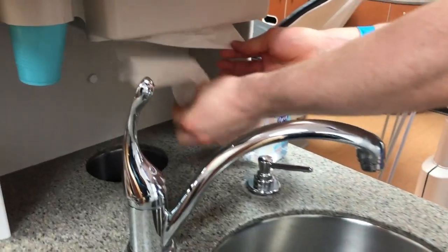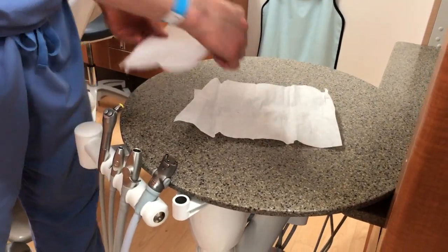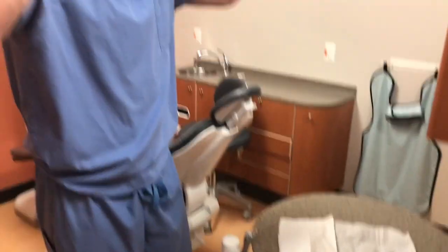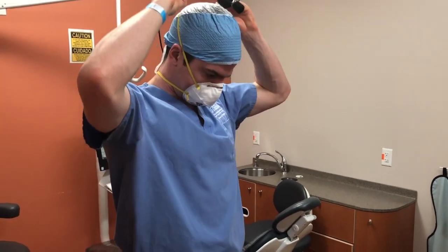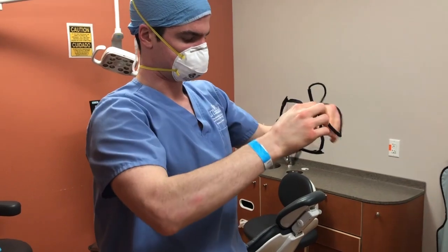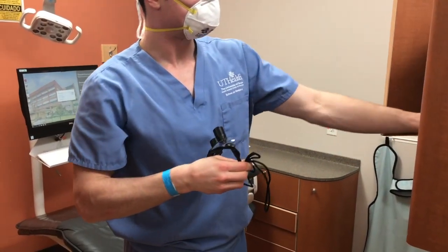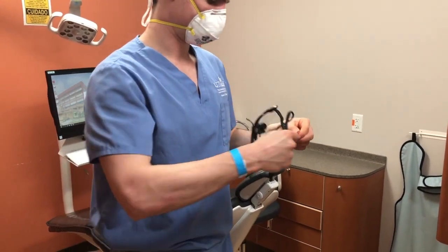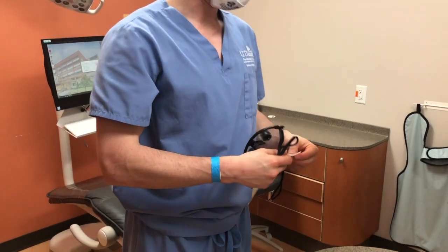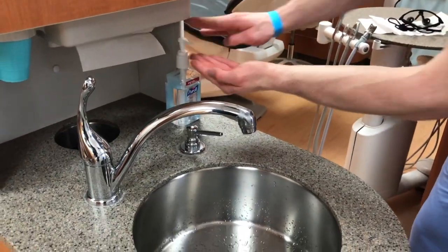Get a couple of clean towels and lay them down — you'll need these to put your loops on. Take the loops off by untying at the back of the head and pulling them away from the face without touching the front. Clean the loops according to manufacturer's instructions and then lay them down on the clean towels. Perform hand hygiene again.